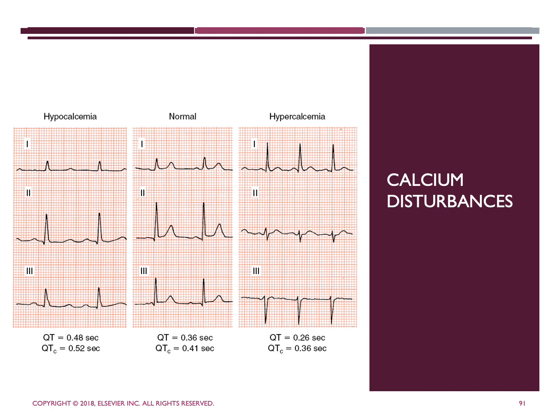So with hypocalcemia, once again, the ST segment is lengthened and the QT interval is prolonged. And with hypercalcemia, what you're going to see is the ST segment is shortened and the duration of the QT interval is decreased. So the opposite between hypocalcemia and hypercalcemia.